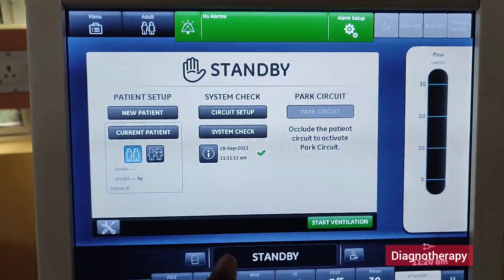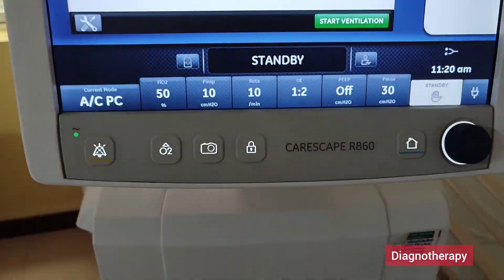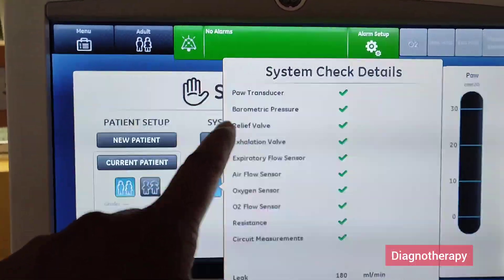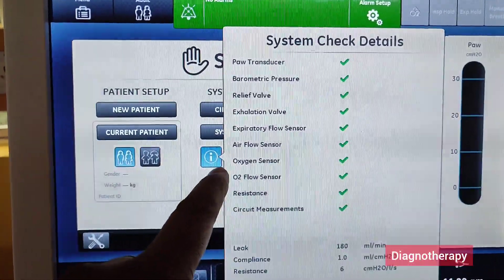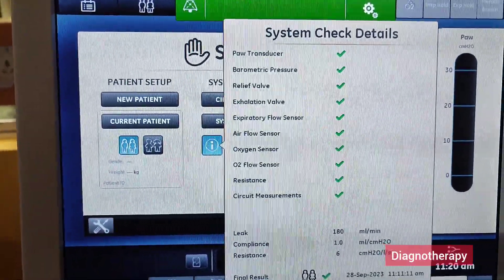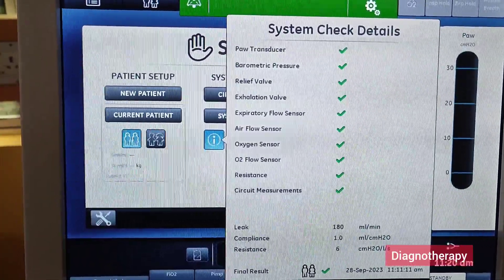In this video we will do the system check of GE CareScape R860 ventilator. Here we need to press the system check button. You can see these are all the parameters that will get checked in the system check. Whenever there is a system check, all these parameters will be checked by the self-testing done by the ventilator.